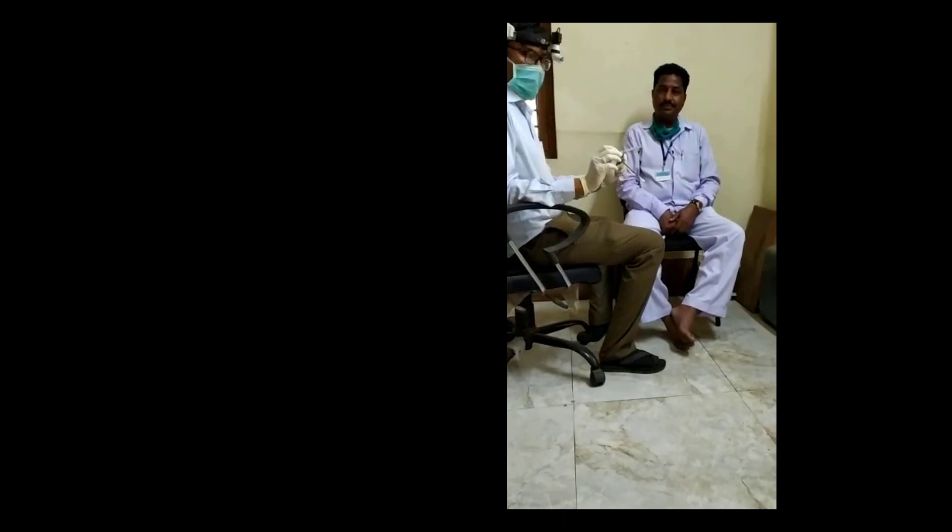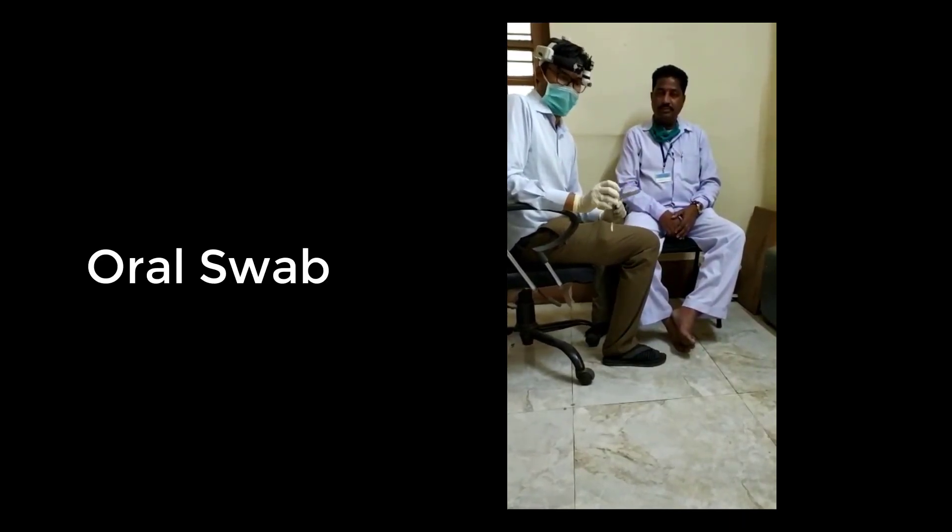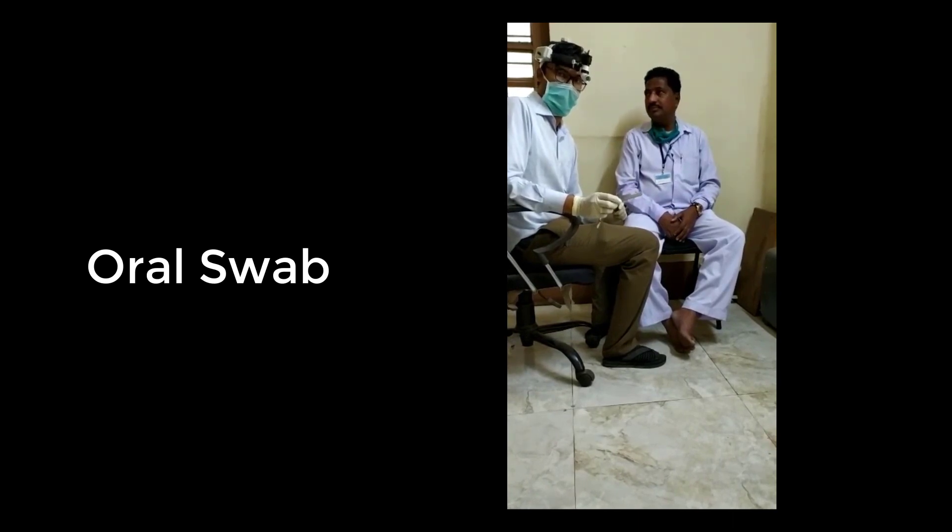I am Dr. Sunil Khoth, an ENT department lecturer from JMC. I will now demonstrate the swab collection from the oral cavity, specifically the posterior pharyngeal wall.